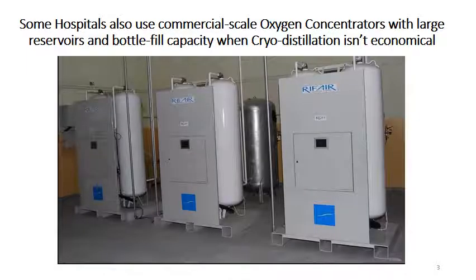However, oxygen concentrators are not limited to small portable home care units. There are in fact commercial industrial sized units which can supply an entire hospital.